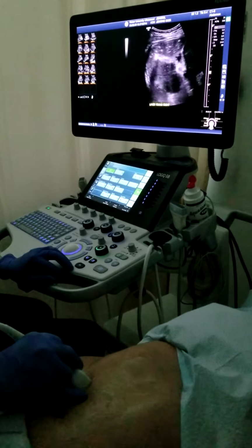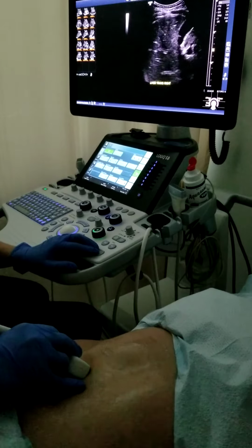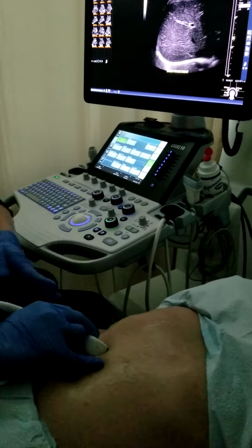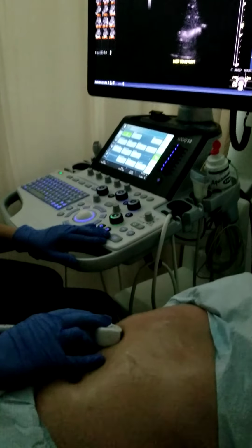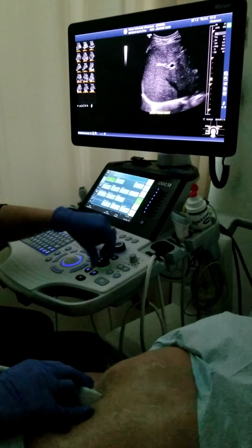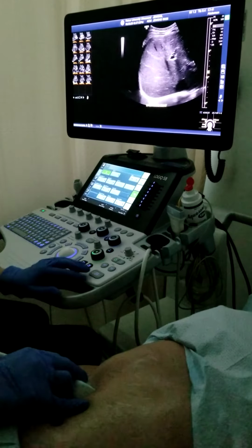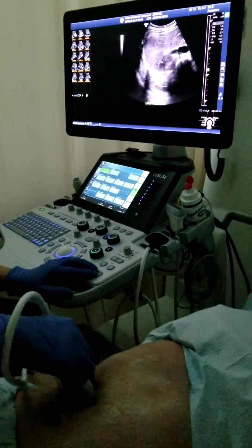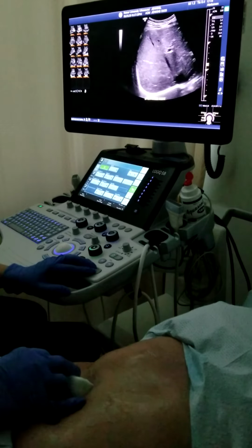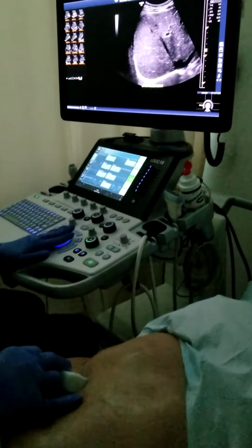My next image is going to be the right lobe of the liver in transverse to look at the dome. Take another breath in when you're ready. So I am subcostal and I'm angling towards the diaphragm. I'm going to sweep all the way up, come back down. I can see my hepatic veins and I can see my transverse IVC right here. You can see this round vessel here is my IVC. So this is all my dome. So I'm going to try to get as much of that in as I can. I'm going to sweep my organ all the way out because we're always investigating each organ. And when I like the picture, go ahead and freeze it.